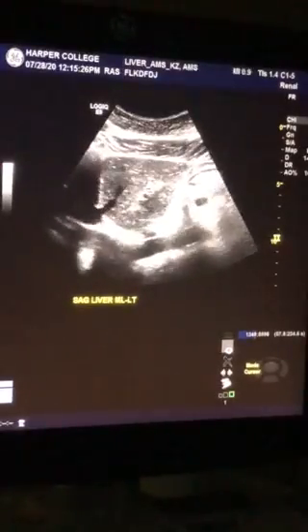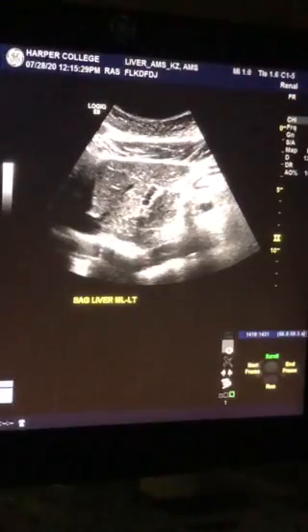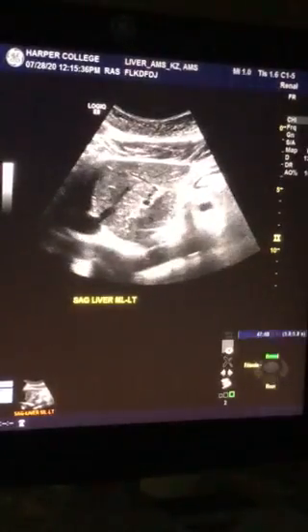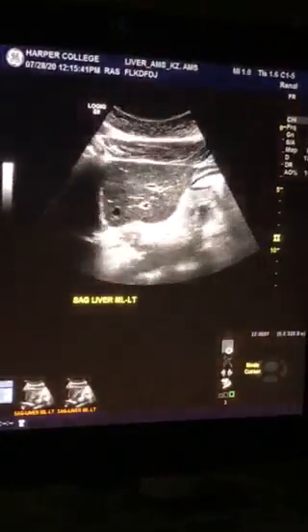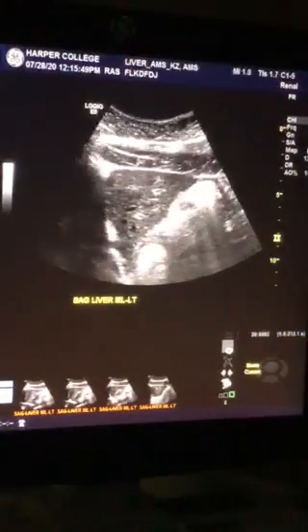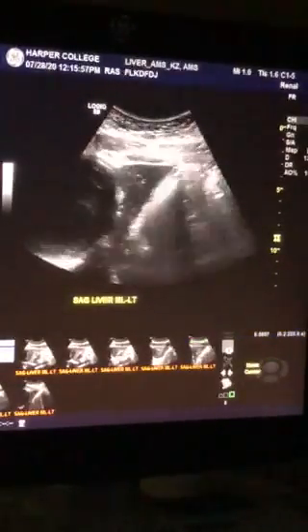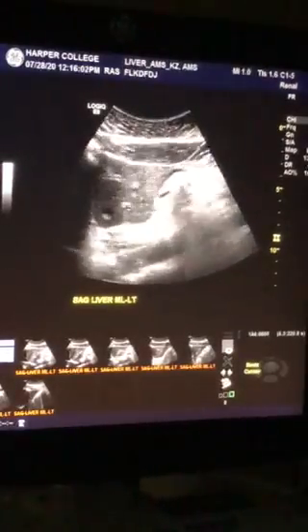So I'm first gonna start by sweeping through the left lobe of the liver. I'm gonna start at the caudate lobe and then slice out laterally. My next image is going to have the aorta in it, and I'm just going to continue to slice out, making sure that I can see all the borders of the liver as I'm slicing. You can breathe. And make sure I go all the way out to make sure there's nothing pedunculated or hanging off of the liver.